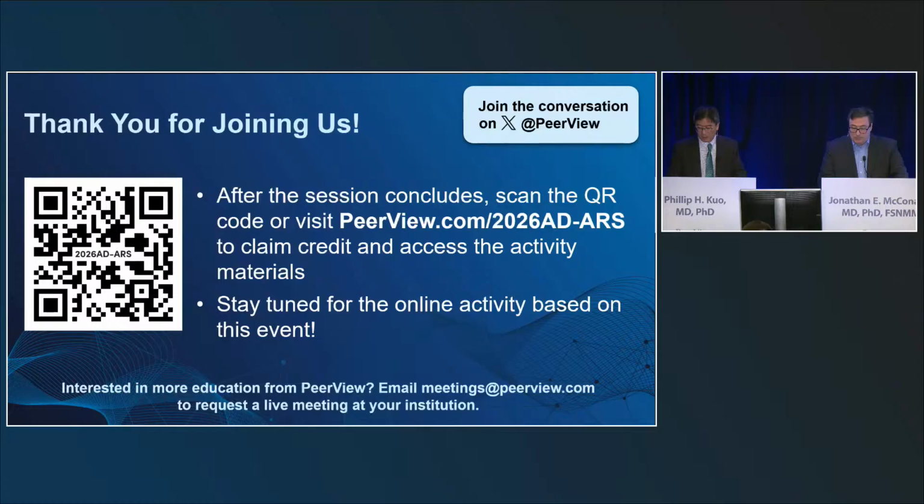Yeah. This question, I guess: how critical is the CT component to the scan? Would you be able to provide the same amyloid analysis with a PET-only brain scan, assuming attenuation correction by atlas is a non-issue? Really, that kind of relates to the PET MRI question. In typical interpretation, you're really just checking for areas of atrophy, that's the key thing you're using the CT for. And even a low-dose CT does a pretty good job for the level of atrophy that would confound the interpretation of that region, so you note to de-emphasize that area of atrophy and focus on areas with less. So I don't think it would really affect much.